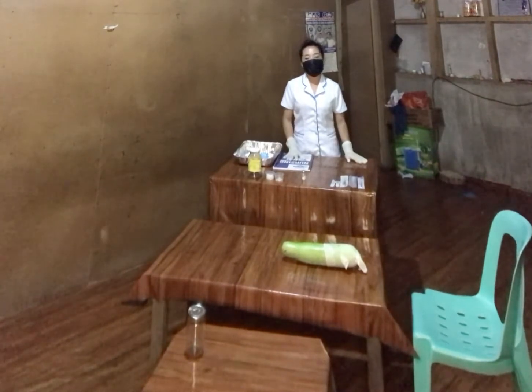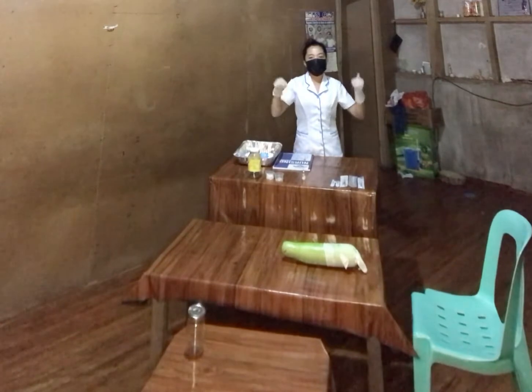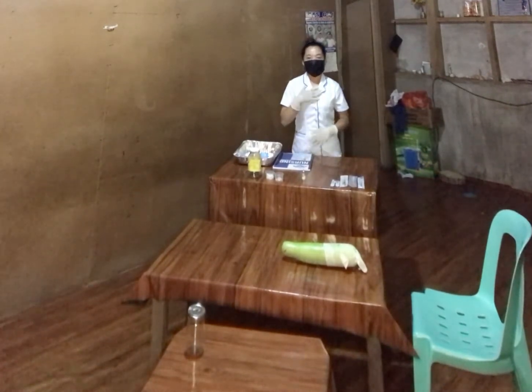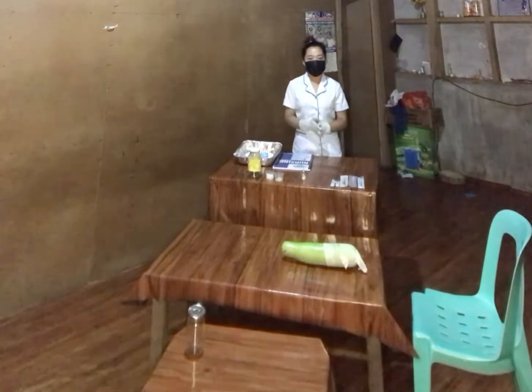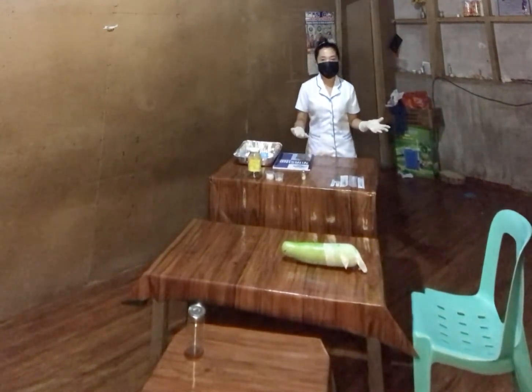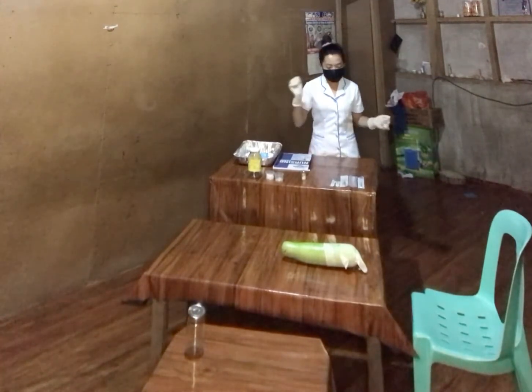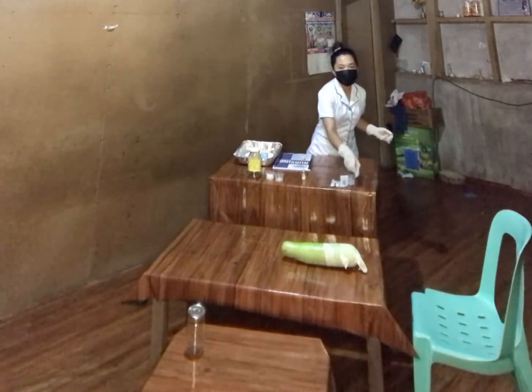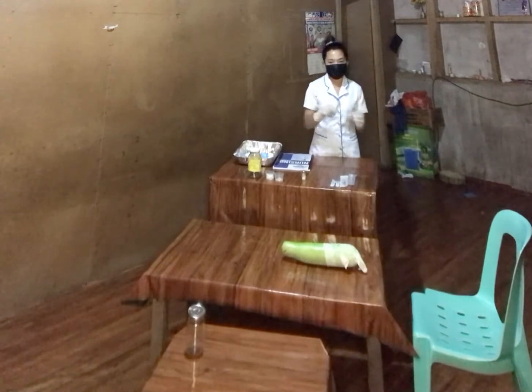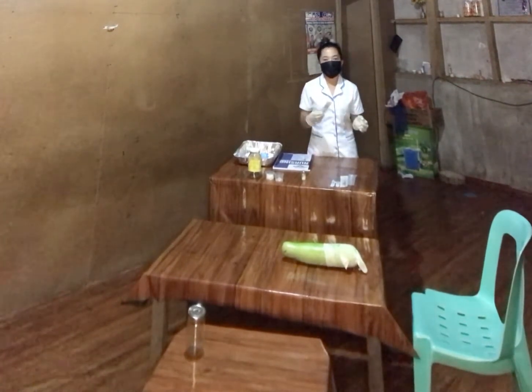So now secured. As you can see, I am wearing these gloves for the safety of myself and for my patient. So let me introduce first all the equipment that we need for the procedure. First we have the syringe. I have a tuberculin syringe, which is ideal for the skin.